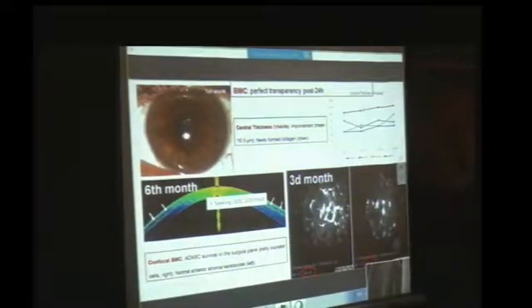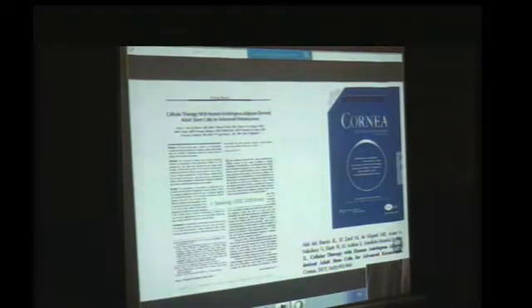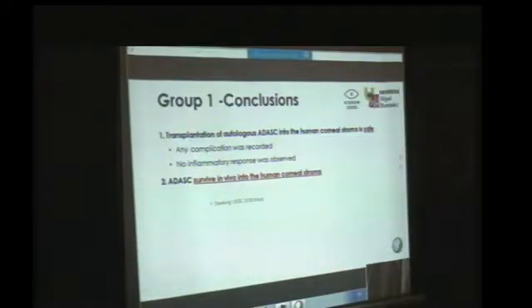Here you have the most important finding of the study. And you see here in the graphic with the OCT, which is in colors, we could identify a new tissue that as a mean was 16 microns at 6 months. So we had the appearance of new collagen in this pocket, and not only was this evident in the OCT, but in the confocal microscopy, there was a clear increase in the cell density that was happening at this time at 6 months. And at 6 months, the trend of the cells that initially were rounded was to become fusiform. That means that they were first transformed into fibroblasts, and then later on they looked like normal keratocytes. These findings were published in Cornea last year, and were the first demonstration that stem cells could be of therapeutic value for the purpose of cornea surgery.